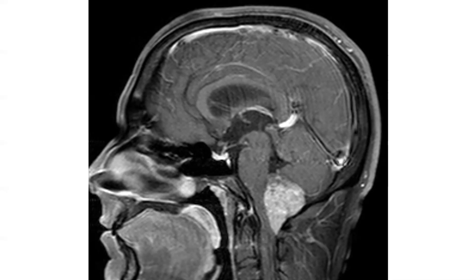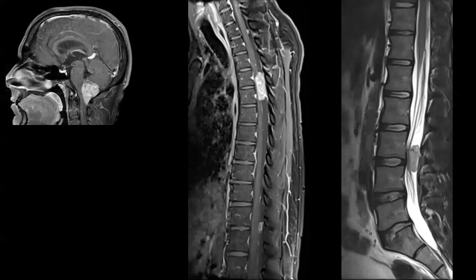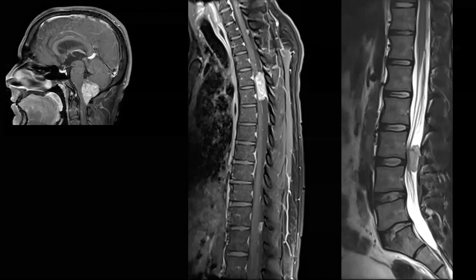Exactly. It's arising from the floor of the caudal part of the fourth ventricle, ependymoma, subependymoma. Listen. In the fourth ventricle, all subependymomas arise inferior or caudal to the stria medullaris in the caudal half, right? Yes, and you need to know that, right? Okay, so what we're seeing here, you can see multiple seeding of the CSF, leptomeningeal disease, bulky disease. All right, so all of this is a metastatic tumor.